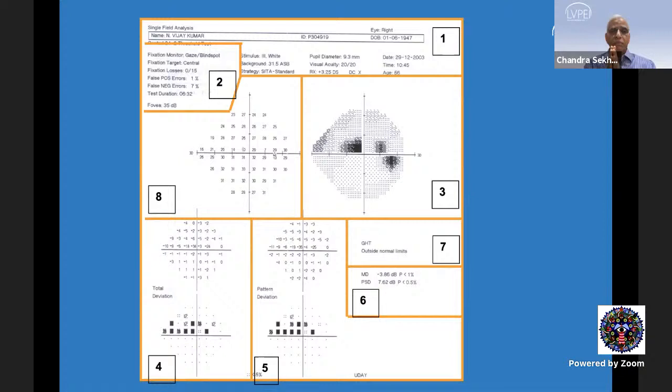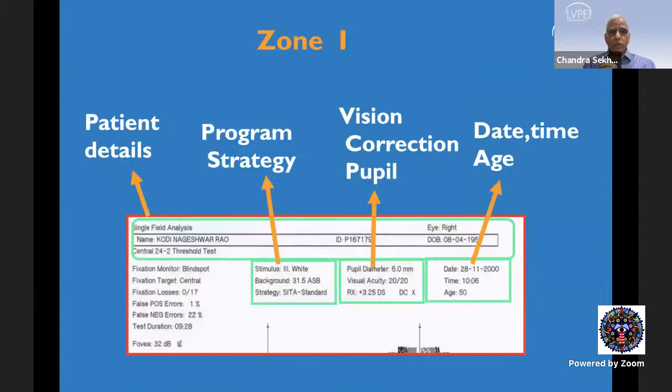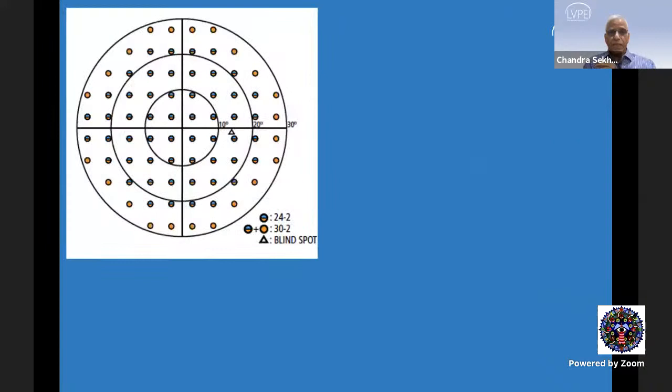To look at the visual field in a systematic manner, people generally divide it into eight zones. In zone one, the patient's details are there — what program and strategy are used, the visual acuity, the correction used, the date and time of the test, and the patient's age. We need to enter the date of birth correctly to get correct comparisons. The use of 24-2 with 6-degree resolution versus central 10 degrees with 2-degree resolution was discussed at length last time.